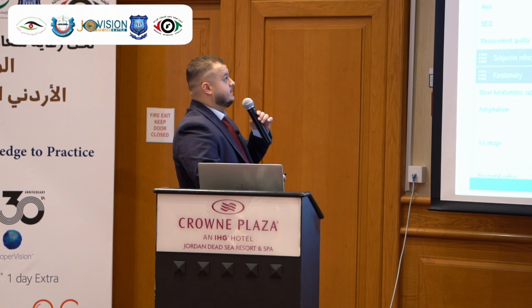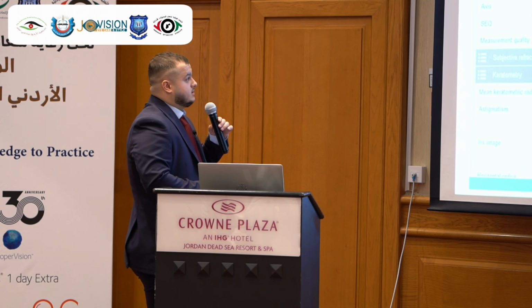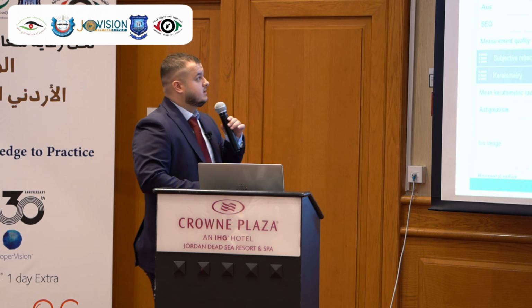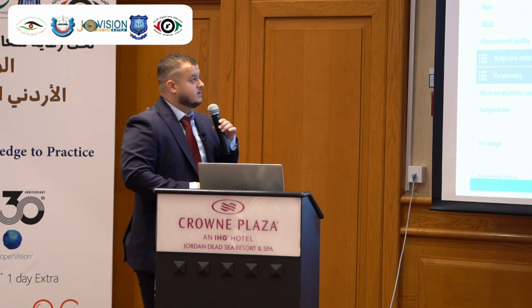In this case, the patient started with us 2 years ago. At that time, we didn't have the Myopia Master measurement, and we ordered the lens according to the K readings and the refraction. 8.14 K reading in both eyes. This is the lens specification for the new case. After using the Ortho-K lens for 2 years, we measured the axial length: 22.65 millimeter, 22.85 millimeter in OS.